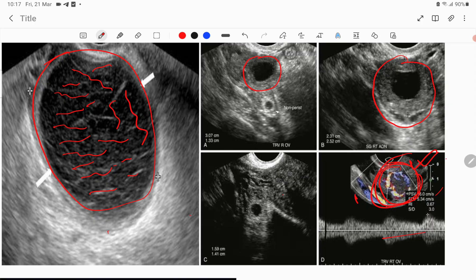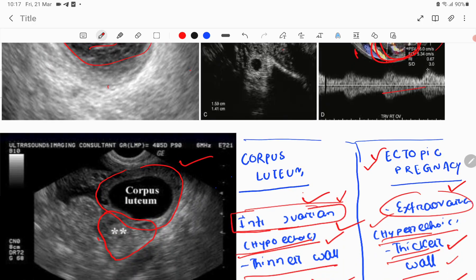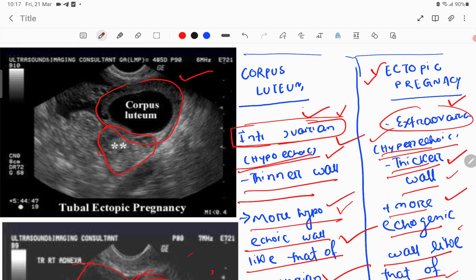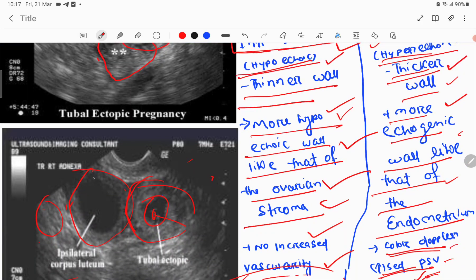This is the ring of fire sign. You can also see the hypoechoic, thinner wall attached to the ovary — this is the corpus luteum. The wall is hypoechoic throughout, and its echogenicity is similar to ovarian tissue.